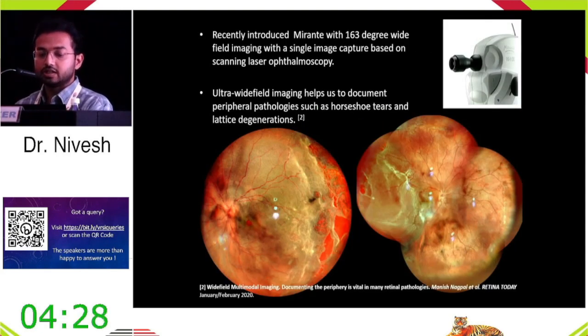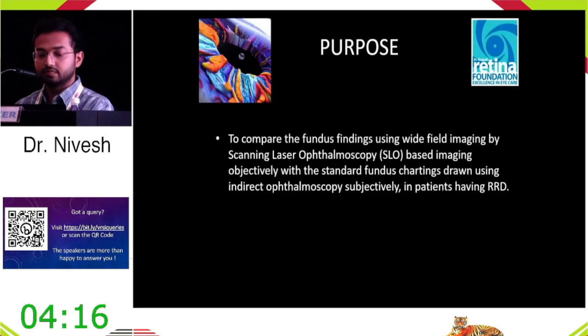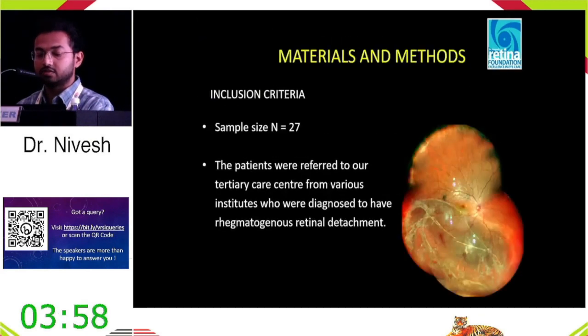Recently introduced is the Mirante, with 163 degree wide field imaging with single image capture based on scanning laser ophthalmoscopy. Ultra wide field imaging helps us to document peripheral pathologies such as horseshoe tear and lattice degeneration. The purpose of our study was to compare the fundus findings using wide field imaging by scanning laser ophthalmoscopy based imaging, objectively, with the standard fundus charting drawn using indirect ophthalmoscopy, subjectively, in patients having rhegmatogenous retinal detachment.